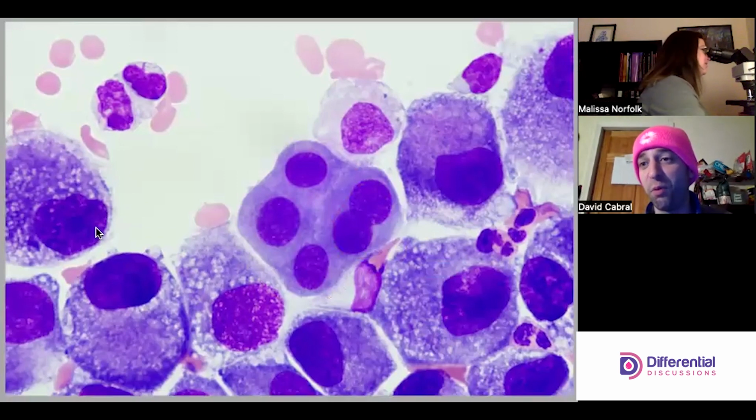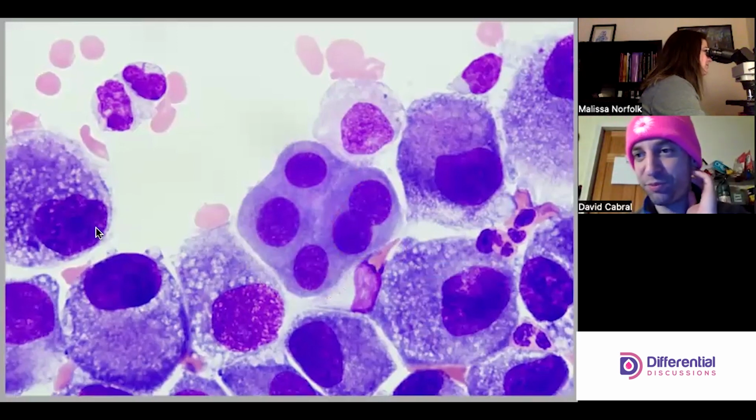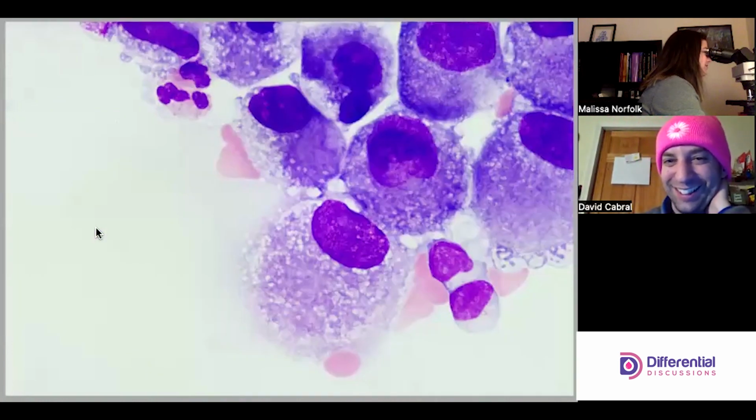I actually want this picture to put in my body fluid teaching. Yes. Awesome.